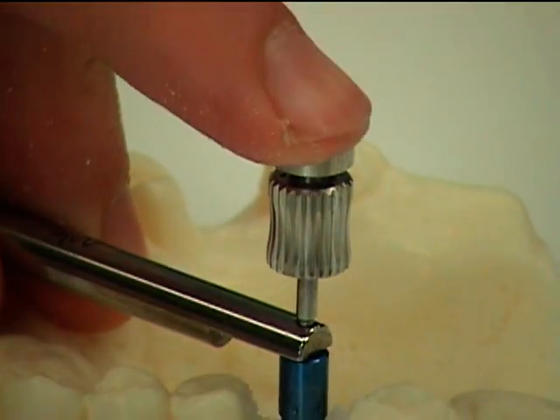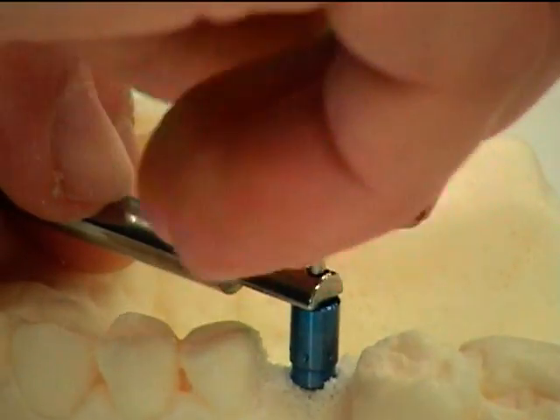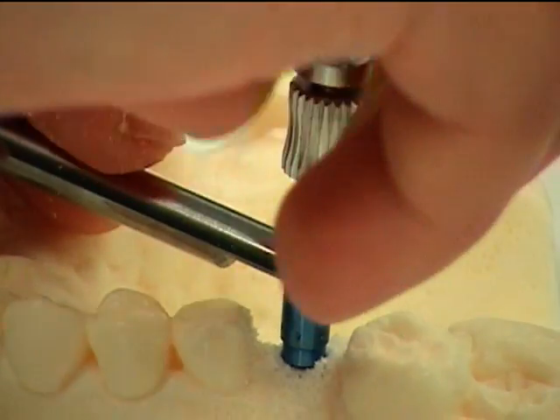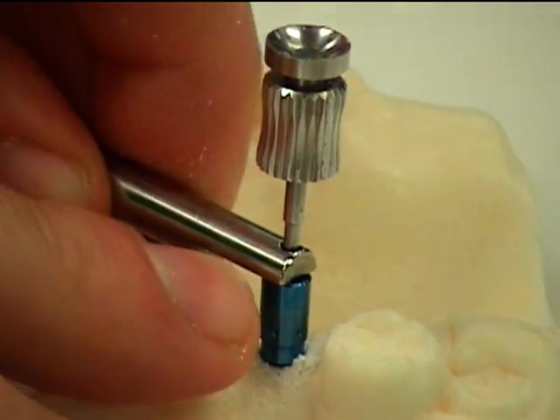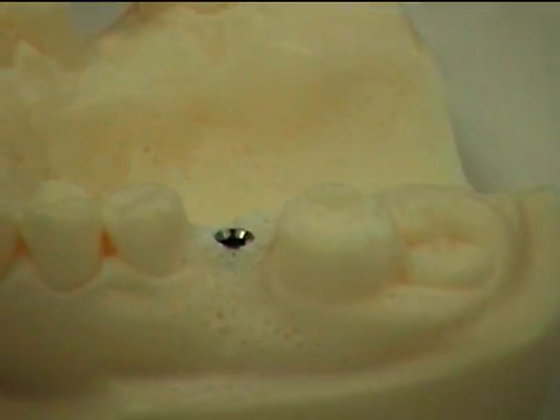Using a hex driver .05 inch to remove the screw. The screws with fixture mount are removed, exposing the implant.